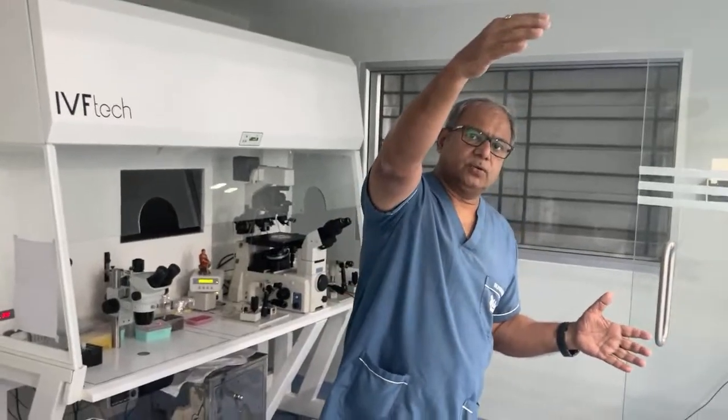These are the systems which normally endoscopy companies don't come with, this type of extension of the OR1 system, which I integrated into that system so that we can record everything, we can transmit everything, and we can do a very good workshop kind of pattern when we need it. We divide it into zone 1, this complex, zone 2 outside the OT complex where you don't have to change the clothes, and third is we go to the auditorium.